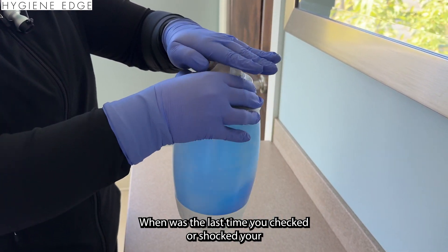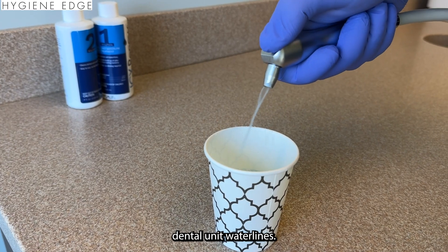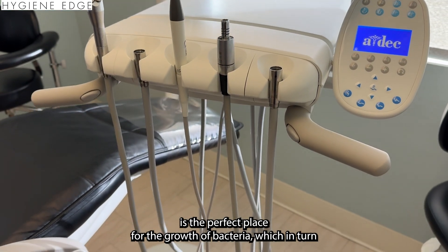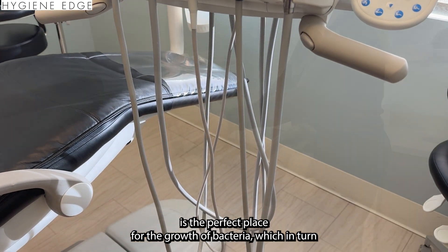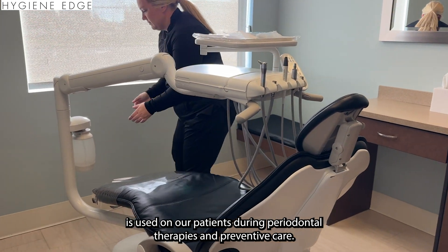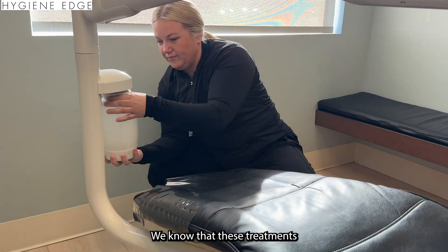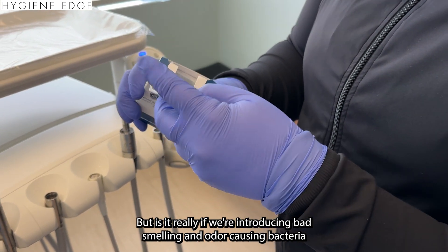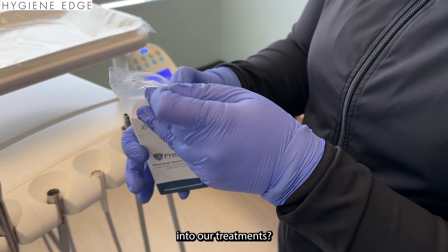When was the last time you checked or shocked your dental unit water lines? Research shows that the small diameter of our dental water lines is the perfect place for the growth of bacteria, which is used on our patients during periodontal therapies and preventive care. We know these treatments are needed to support better oral and overall health, but is it really helping if we're introducing bad-smelling and odor-causing bacteria into our treatments?